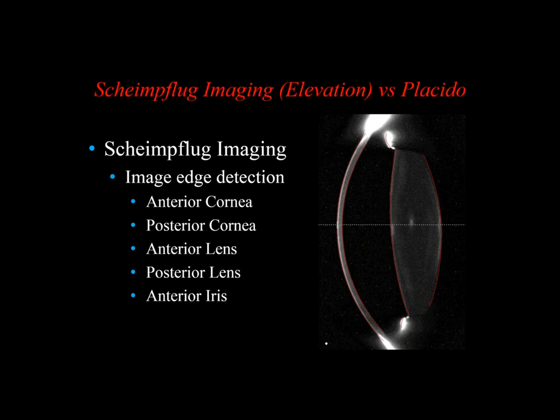It also measures the anterior lens and the posterior lens. And if you can measure the anterior lens surface and the posterior cornea, you can measure the anterior chamber depth also. This is an eye that was dilated widely, so you really don't see much of the iris. It also measures lens transmissibility. Again, this is just a single optical cross-section, and the Pentacam uses either 25 or 50. Most people default to the 25 scans, and then it recreates in 3 dimensions, like a CT, to form a 3-dimensional image of the anterior segment.